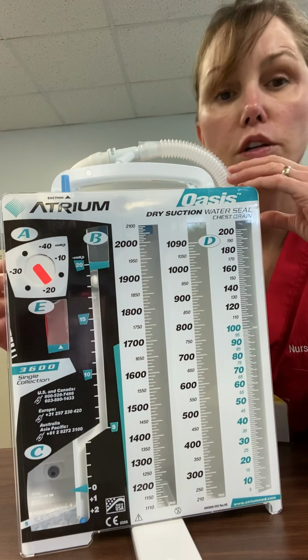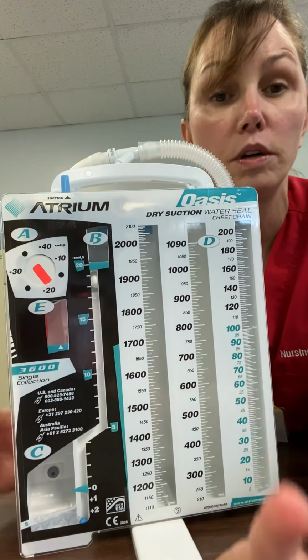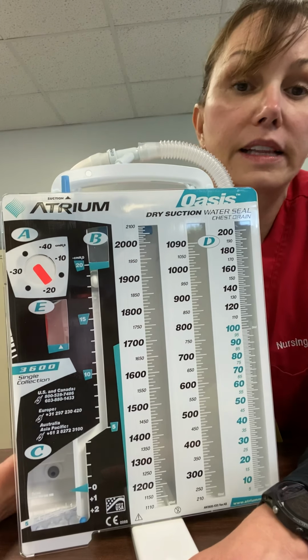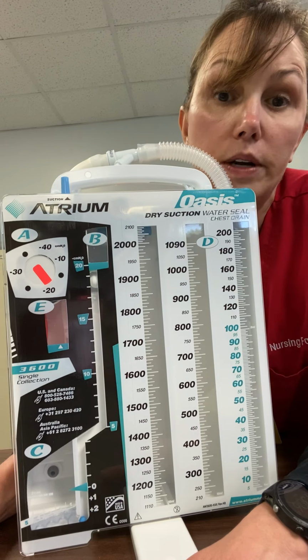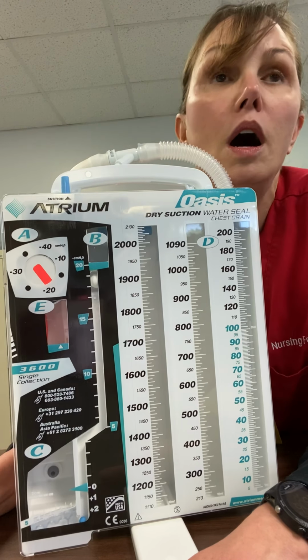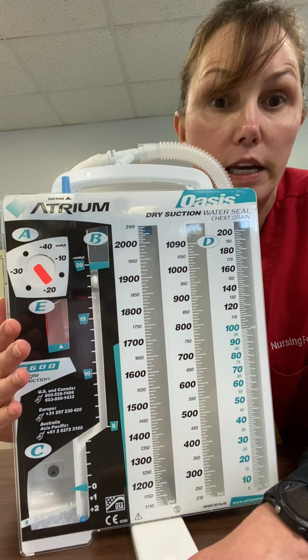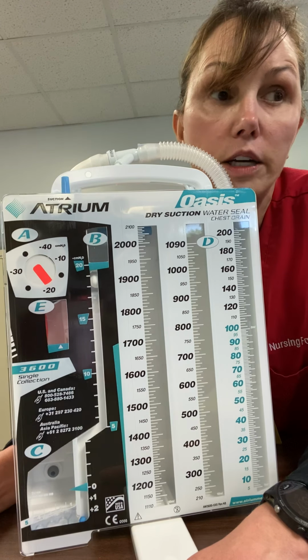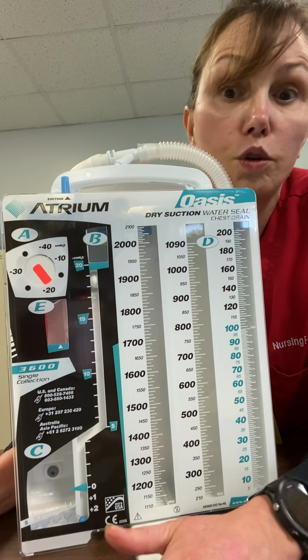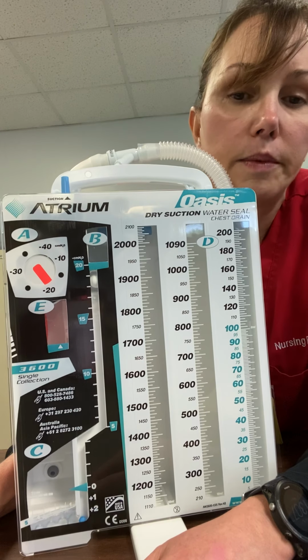There's a little toggle over on the side that I can set, and this one is set for -20. Now, the one difference is that this wet one I just showed you, the Pleurovac, can only go to -20. This can go up to -40. So if a physician wants more negative pressure exerted, they could use this dry closed drainage system, or maybe it's the only closed drainage system they have in the organization, and they would use that as well.